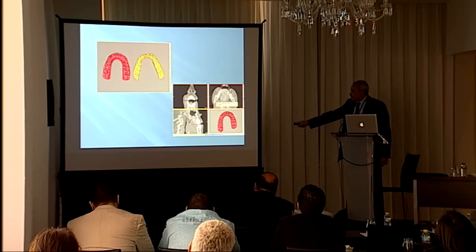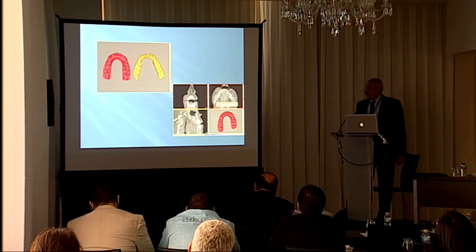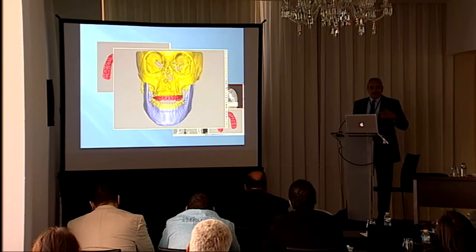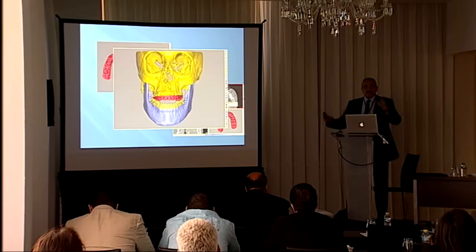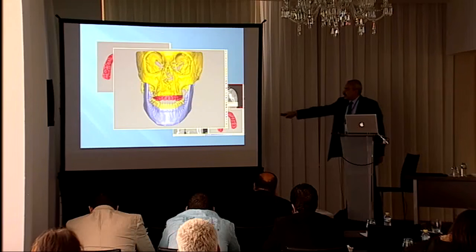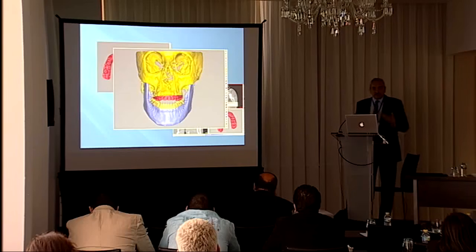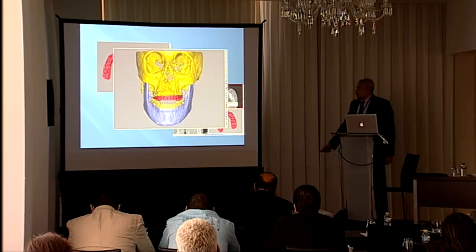We assign points here in the 3D model, and we assign the corresponding points on the CT scan. Then the computer takes the model picture that is error-free, that is scatter-free, and puts it on the teeth section, so we can see the teeth on the virtual model quite accurately.